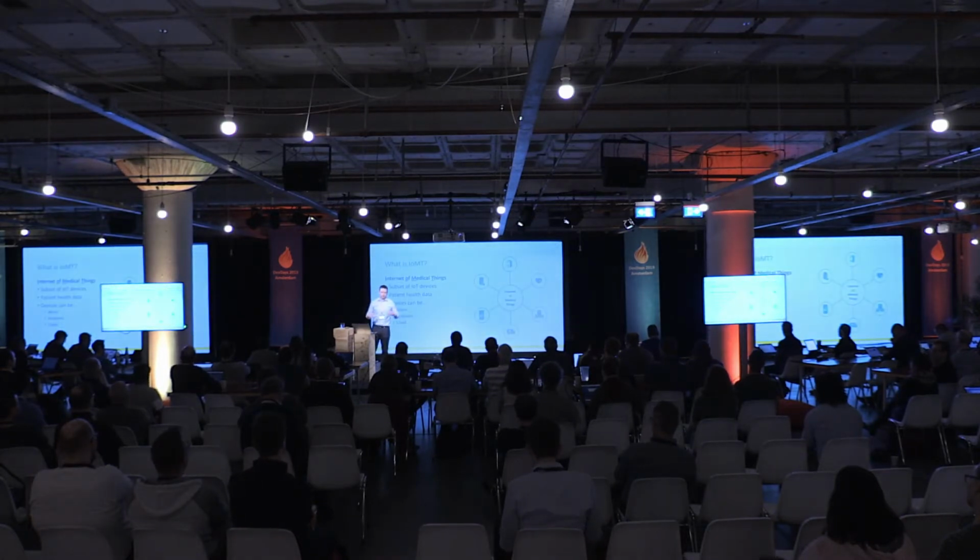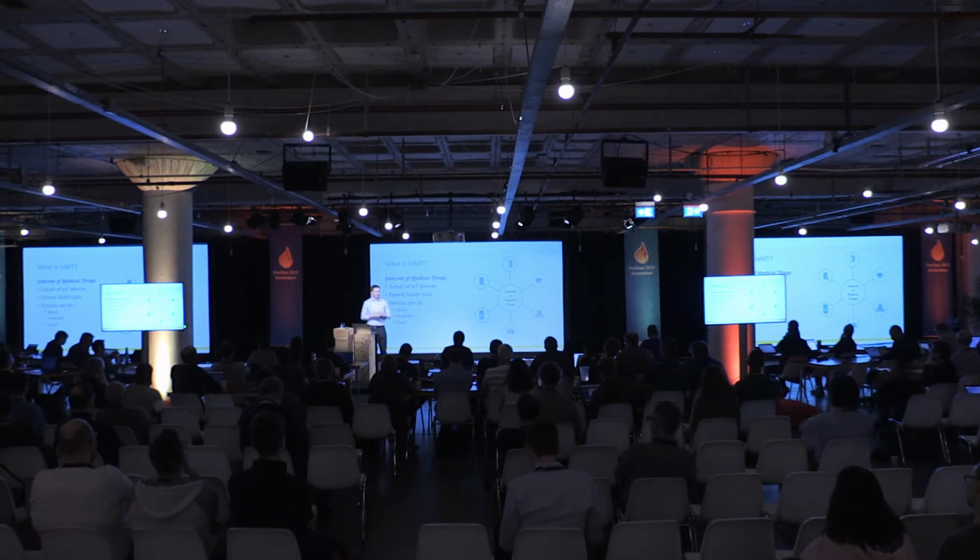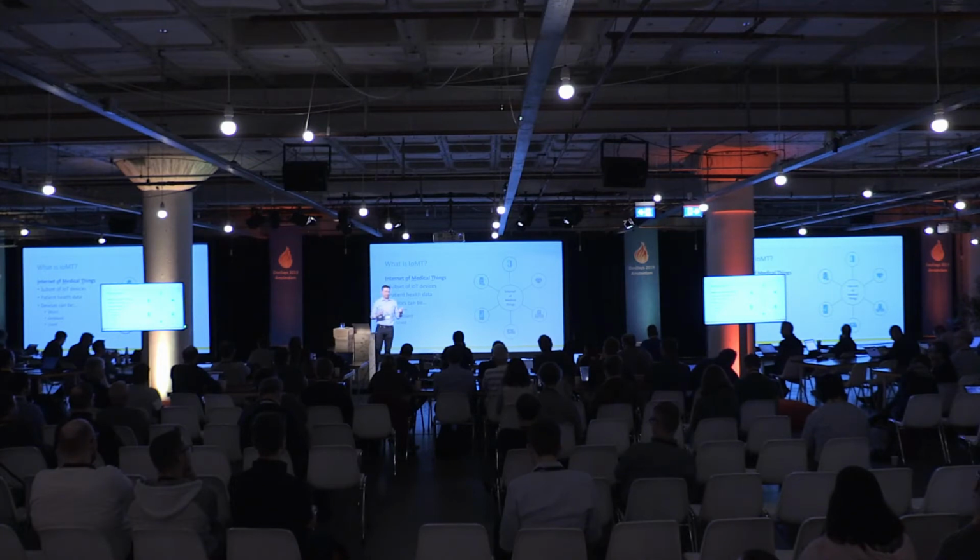So, to begin, what is IoMT? Well, you've heard me say that a couple times already, the Internet of Medical Things. You can consider it a subset of IoT devices, or Internet of Things devices, that are pervasive now. They're everywhere. We have smart fridges, smart thermostats, smart doorbells. Well, you can think of this subset as being a special case because it has patient health data.